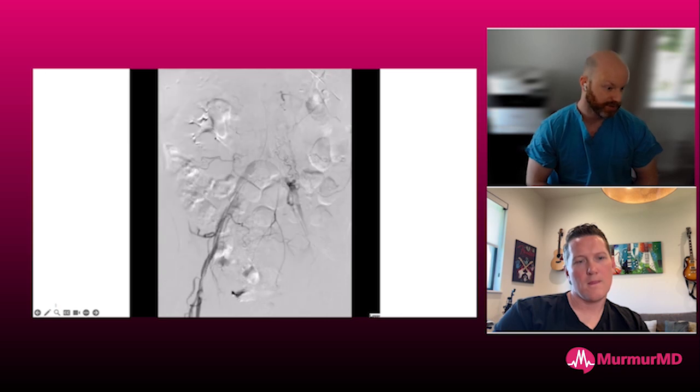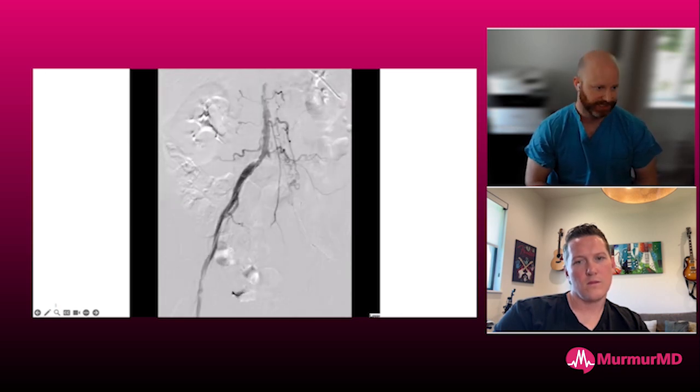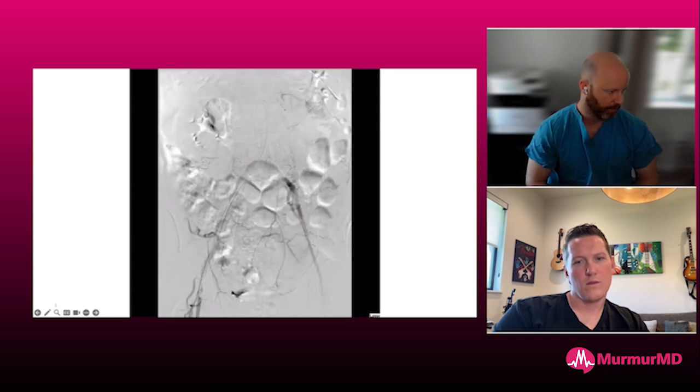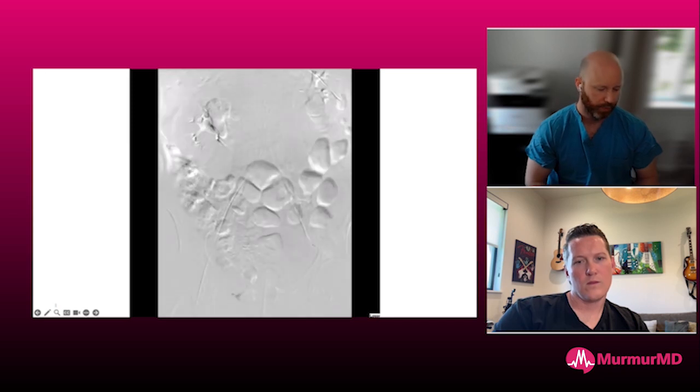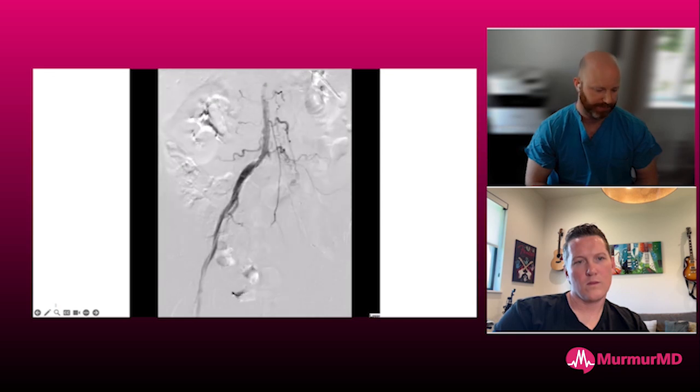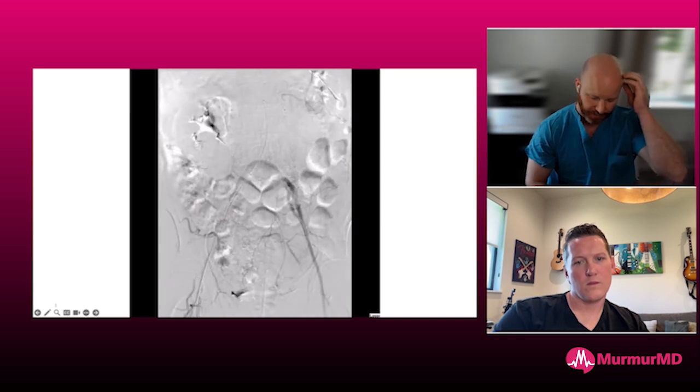Once we know that this is good, in this case we feel like this is a good result, then we go ahead and just wire our pigtail again, take our sheath out, tighten our Perclose over a wire, and then once we have hemostasis with that, we take our wire out and then lock our Percloses completely. Some people lock one of the two Percloses. We're a two Perclose site. I have done one Perclose, but then we've had problems when we were trying to bail out with things. And so I typically deploy two Percloses.